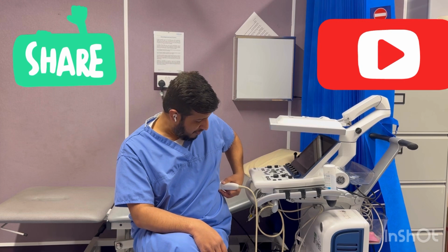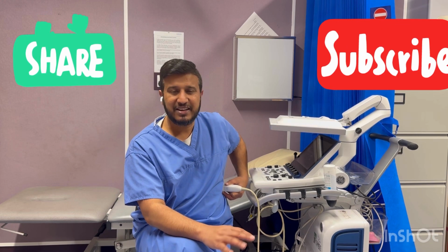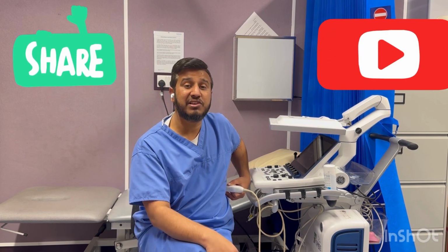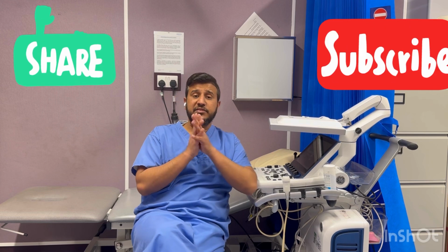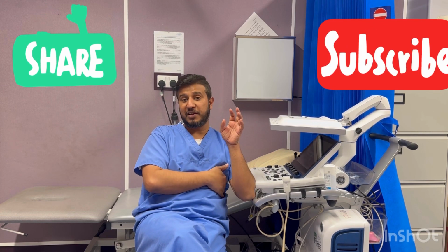If you move your marker slightly more, around 10 o'clock, or 10 to 9, or maybe slightly 11 o'clock, you can say 10 to 11 o'clock, you will get your 3-chamber view. Okay, so this is how you are going to get it. This is all you can do, like 4, 3, 2. You will get these images in the apical windows.